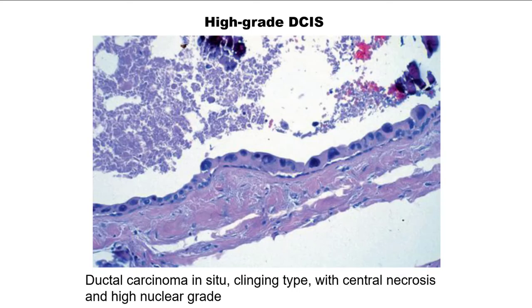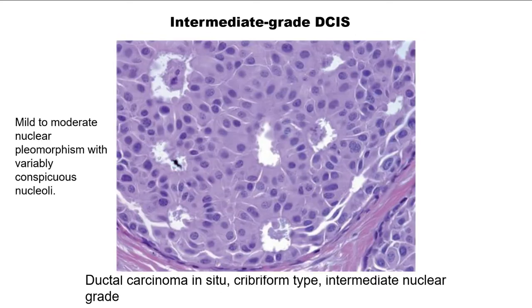Here is another example of high-grade DCIS — the clinging type — where you have essentially a single layer of malignant-appearing cells, with some central necrosis in this case. Here is an example of intermediate-grade DCIS showing mild to moderate nuclear pleomorphism and variably conspicuous nucleoli.